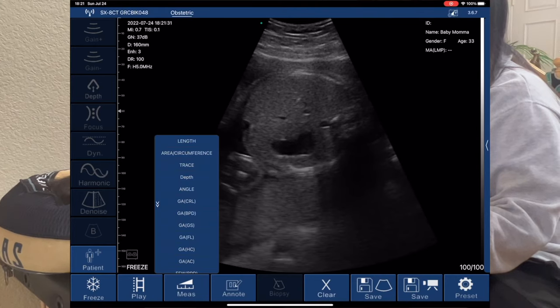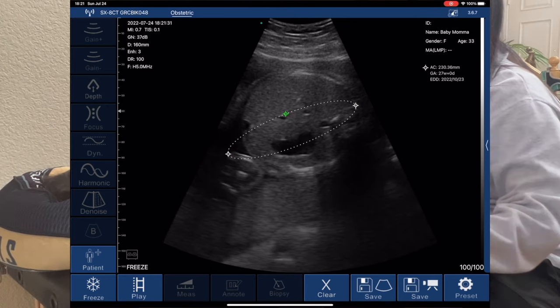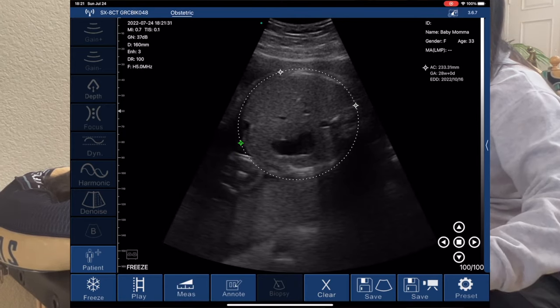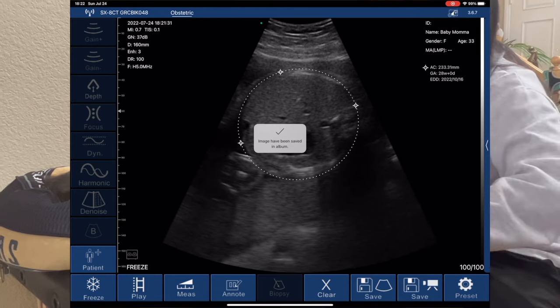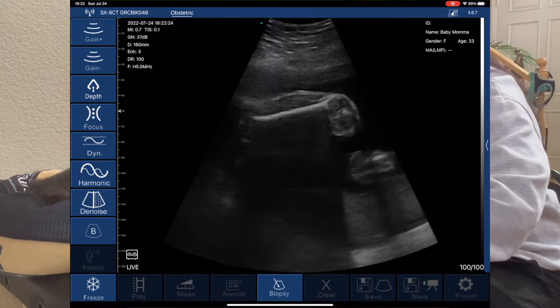Moving forward to baby being around 28 weeks, we can see the abdominal cavity very clearly, as well as the umbilical cord and the femur length.